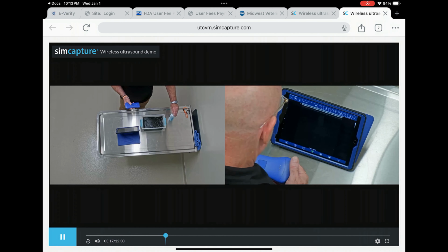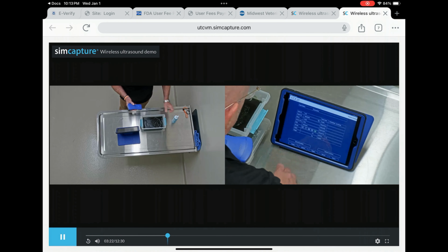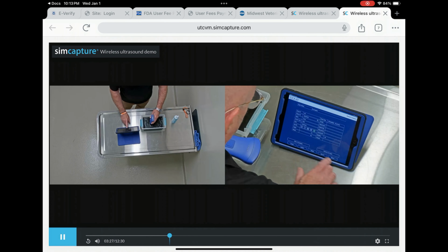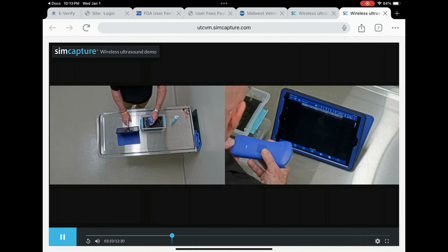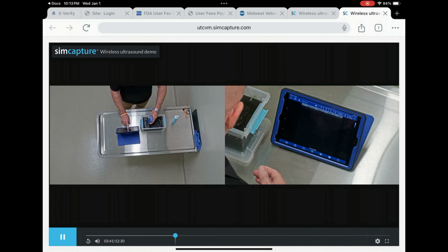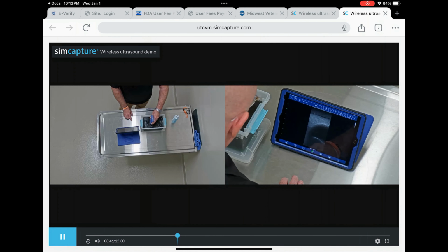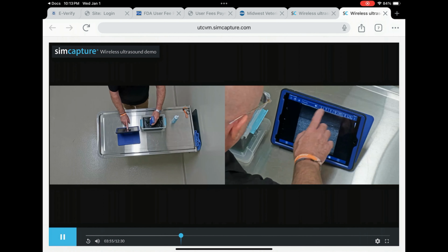I'm going to simply scan a model that our technician administrative team has put together for us, and I'm going to be scanning with the linear end of the probe, and here's what a bladder might look like with a linear scan. Now this is 8 centimeters deep. We can switch depth on the screen with a fingertip, and we can scan from 2 centimeters, 4 centimeters, 6 centimeters, and 8 centimeters. So there's the tissue planes that we would be scanning in the patient. This is referred to as a bladder here in our image, and the white outline here in the bladder would be considered a stone. So there's our depth change.